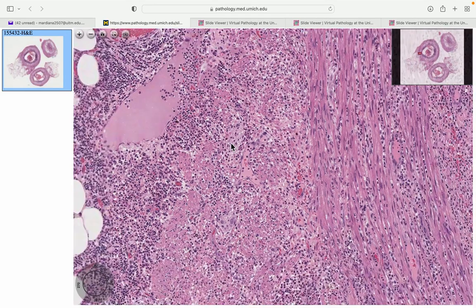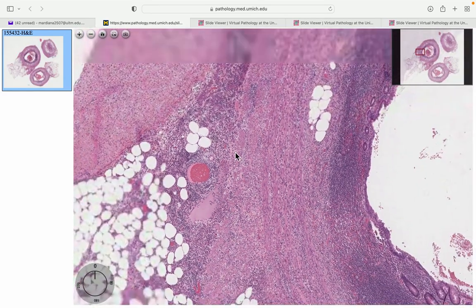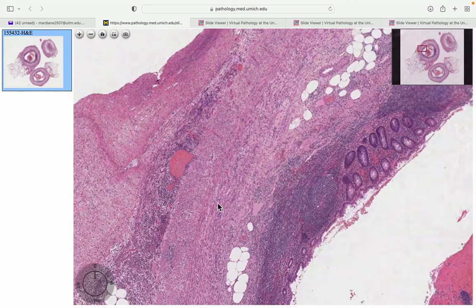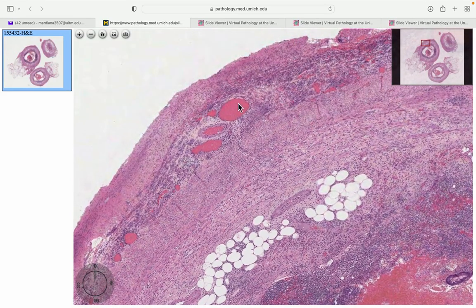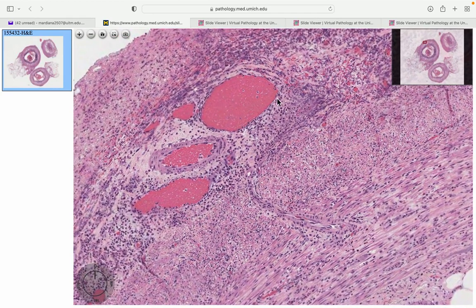Next you want to look for the vascular congestion, so vessel dilatation and congestion. Usually the vessels are not that obvious. In an inflammation, there will be an increase in diameter and more blood flow, so they will look more red and congested. These are all your dilated and congested vascular channels. See, these are all very open and filled with red blood cells because they are now congested and so full of red blood cells.